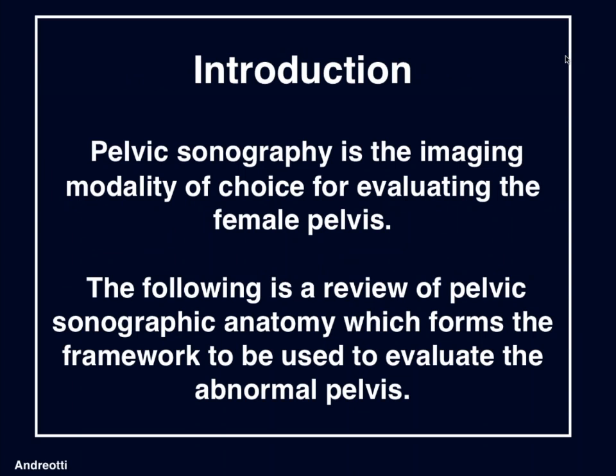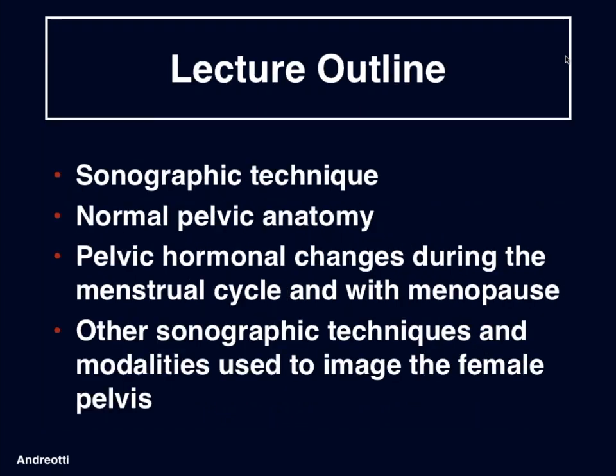So pelvic sonography is the imaging modality of choice for evaluating the female pelvis. So we're going to be reviewing pelvic sonographic anatomy, which forms the framework to be used to evaluate the abnormal pelvis. During this lecture, we will review sonographic technique, the normal pelvic anatomy, pelvic hormonal changes during the menstrual cycle and with menopause, and other sonographic techniques and modalities used to image the female pelvis.